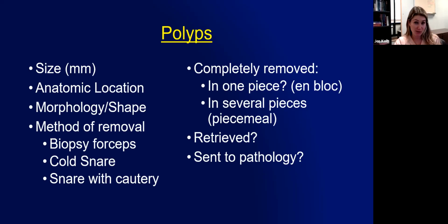I told you it was removed. I said it was completely removed. So we think it's an adequate resection. And retrieved. Retrieved means that there's going to be a pathology requisition, right? That somebody's going to have to follow up the path.